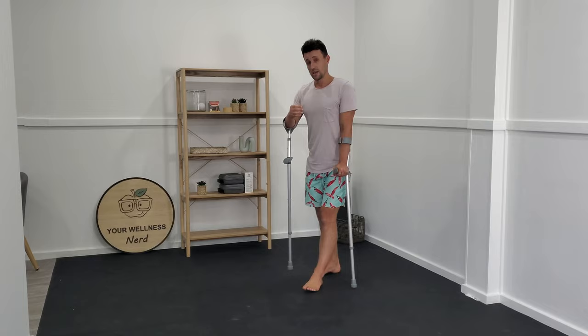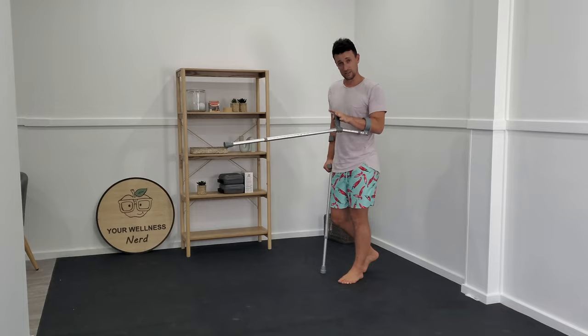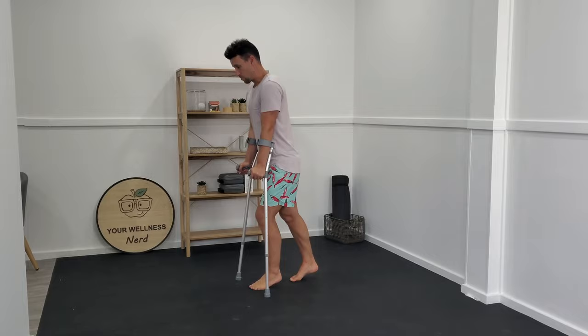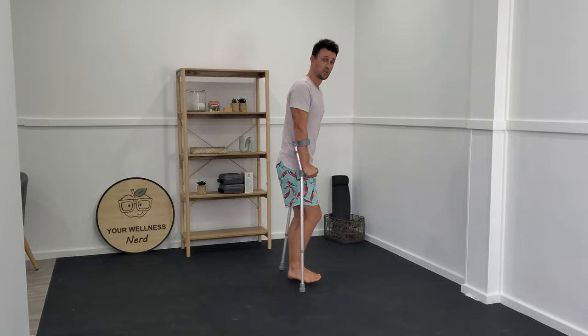Whatever technique you find, it has to be specific to how you feel on any given day, with the knowledge that if you can put the tiniest bit of body weight through your foot to begin with, as your tissue naturally becomes better, you'll more intuitively start to load up more and more of your body weight without anybody actually needing to tell you how to progress this yourself.